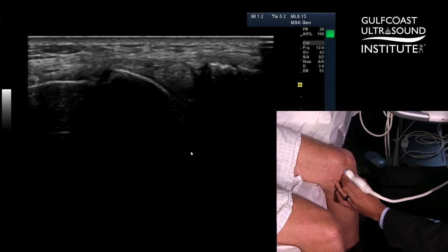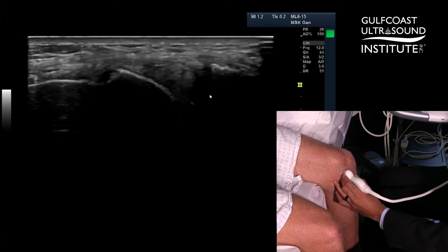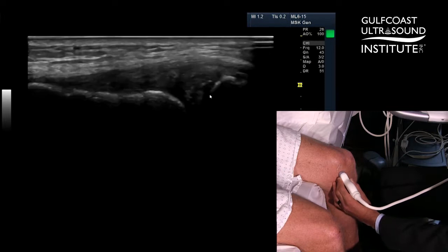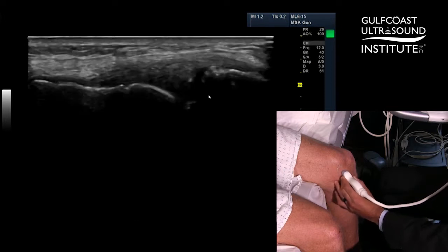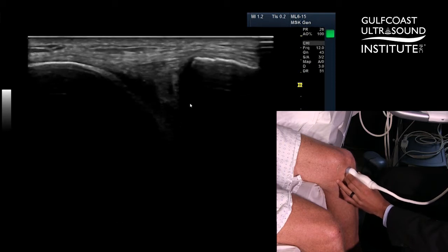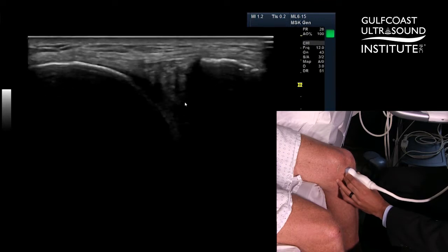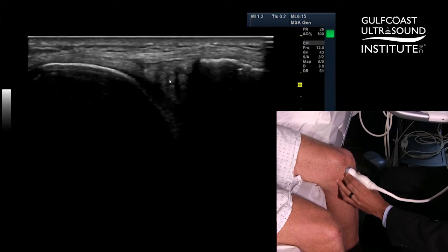You'll see when you have the ultrasound probe in the right position, you'll see the wedge-shaped meniscus in between the curved distal femur and the proximal tibia. And you want to scan posterior to anterior to interrogate the entire length of the anterior horn of the medial meniscus. What you're looking for are little interstitial tears as seen here.